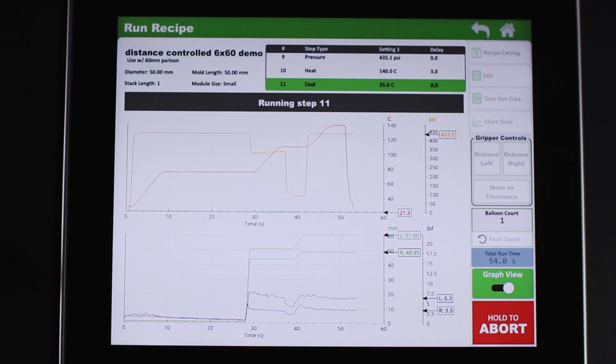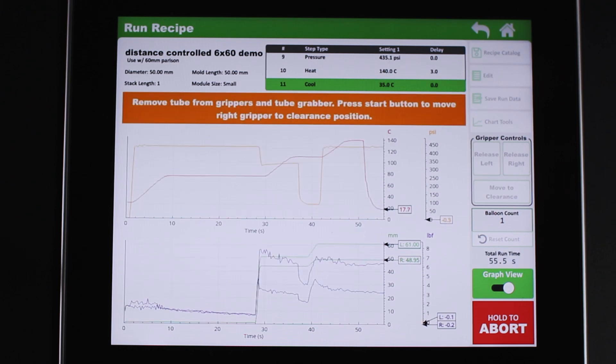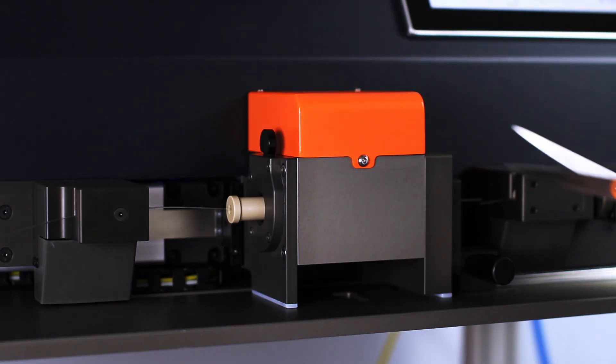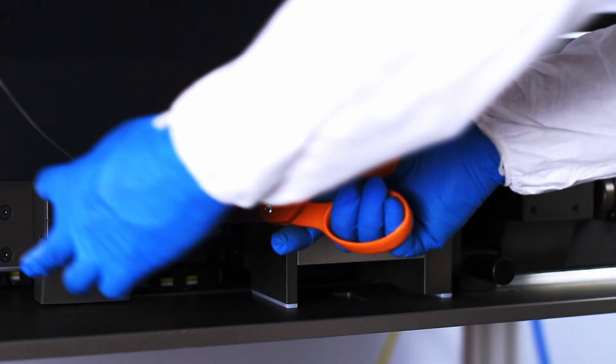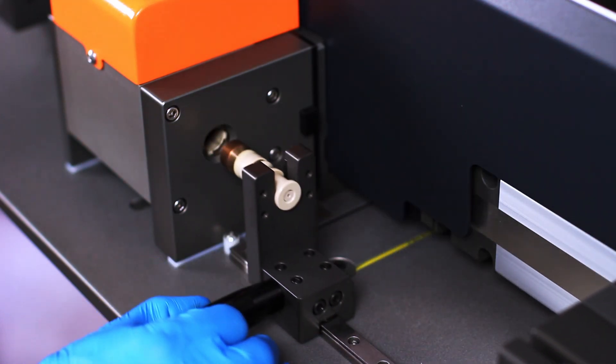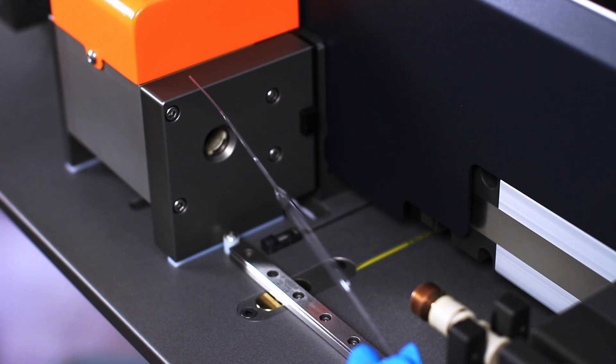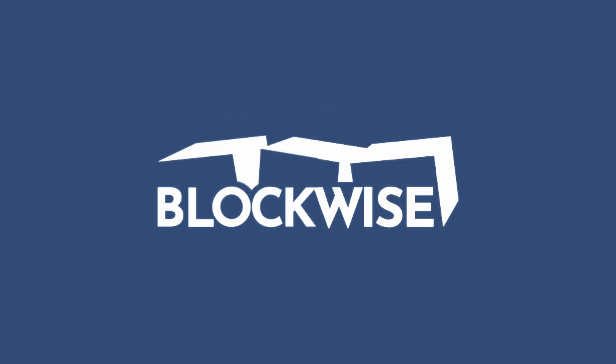Once the recipe cycle is complete, the balloon can be removed by following the instructions displayed on the screen. Cut the tubing on both sides of the module, then push the start button to move the right gripper to the clearance position. Finally, pull the end plug carrier away from the module and remove the balloon from the mold.